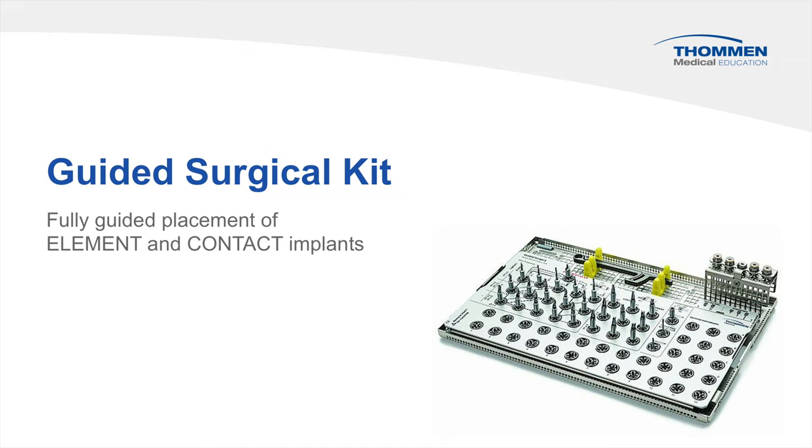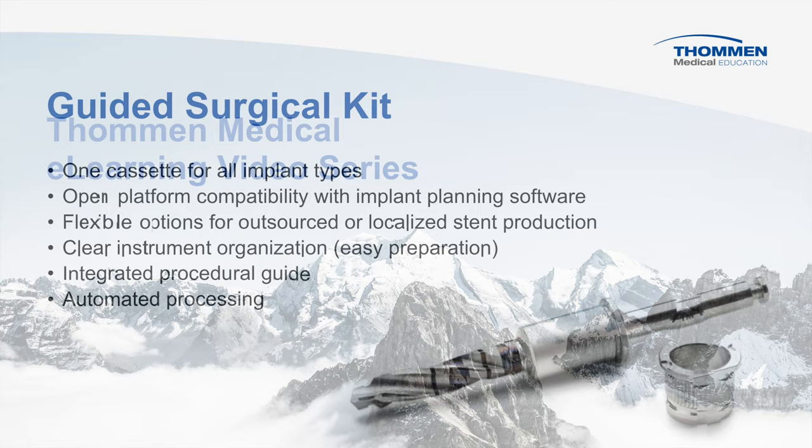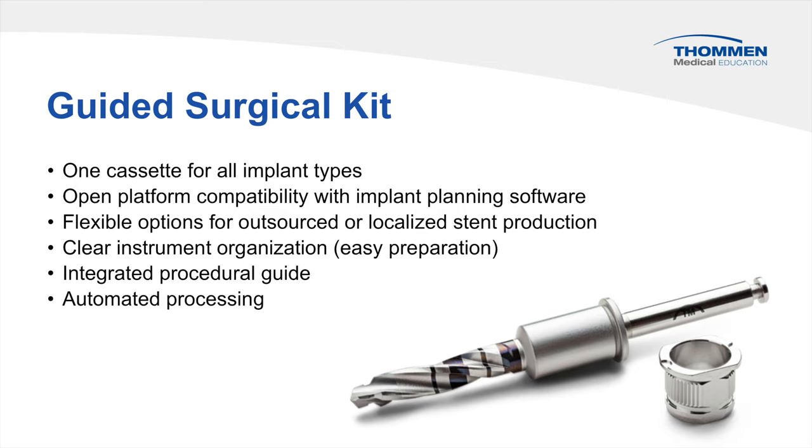Introduction to the guided surgical kit from Tomin Medical. This video is part of the eLearning video series. The guided kit covers both element and contact implants. The open platform compatibility provides flexible options with implant planning software, with outsourced or localized stent production.